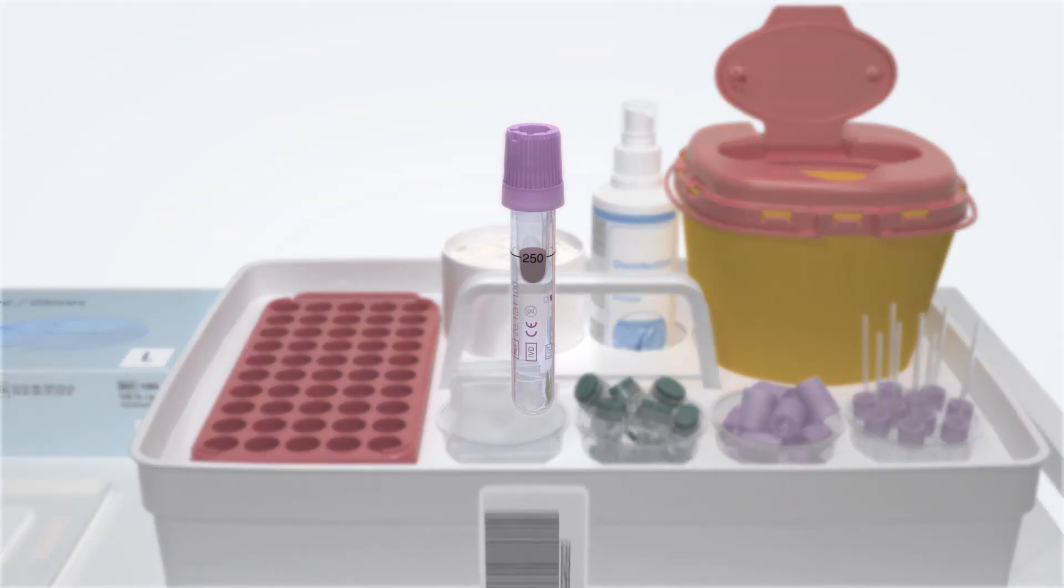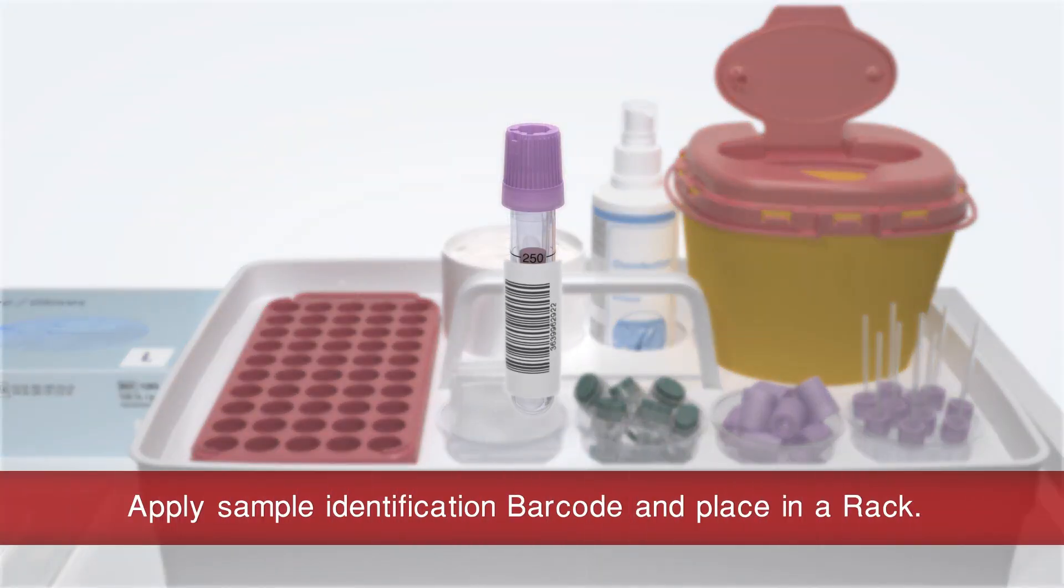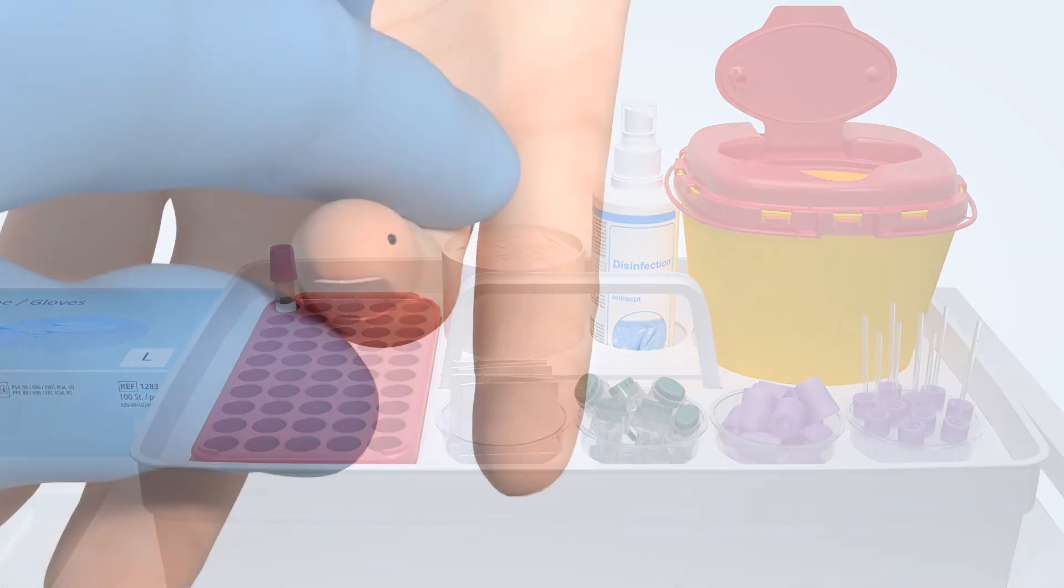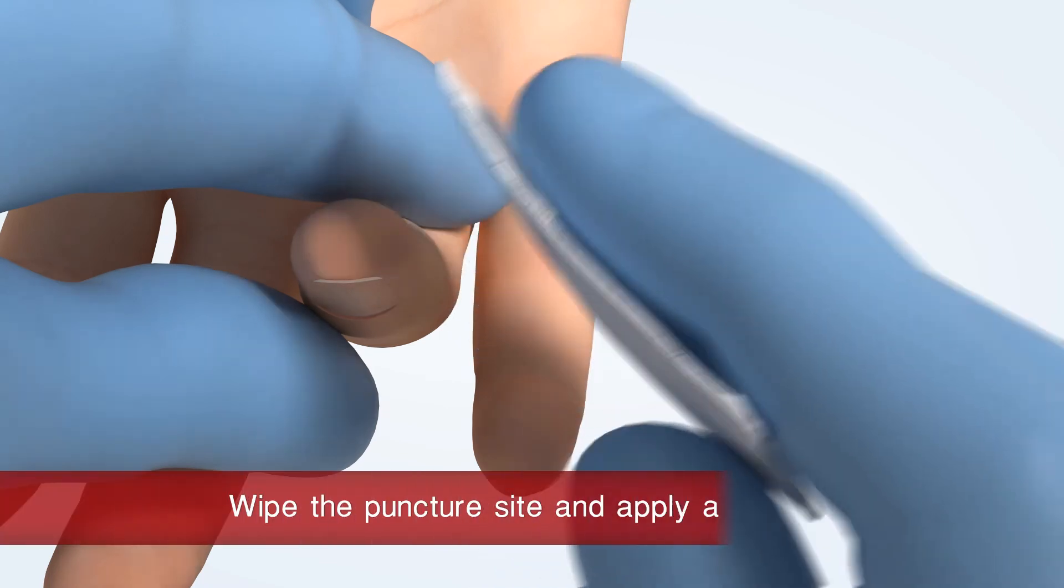Affix the patient label on the Microvette APT and place it in an S-Monovette rack. Wipe the puncture site with a swab and apply a plaster.